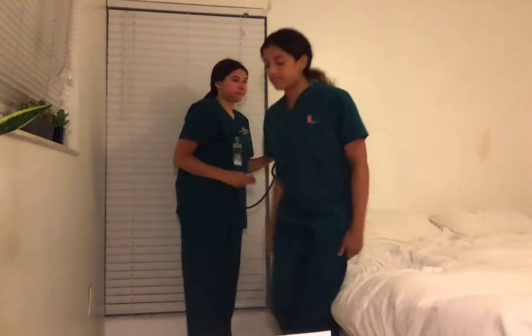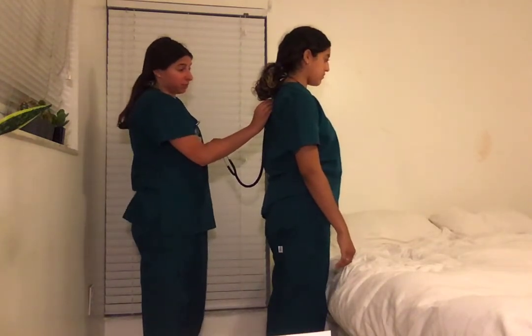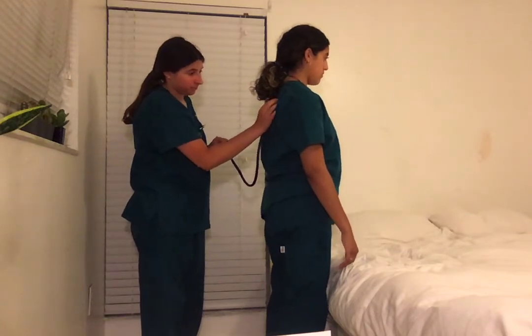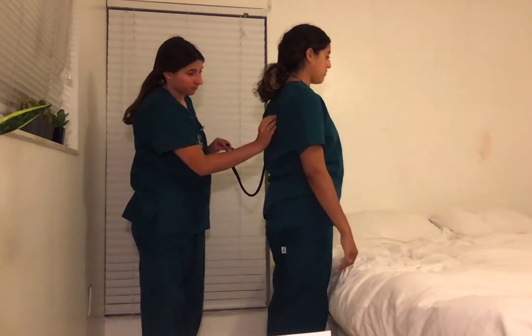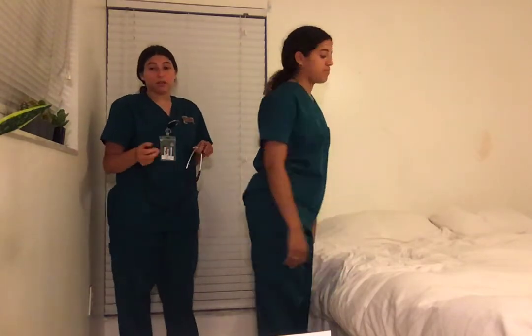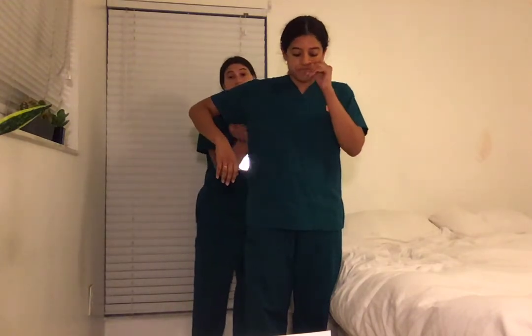Can you stand up? And here I'm listening for the inspiration and expiration to sound equal. And this is on either side of the spine. Now I'm going to listen for the vesicular sounds, in which inspiration would be greater than expiration, and that's going to be on the sides. So I'm going to have the patient raise her arm.